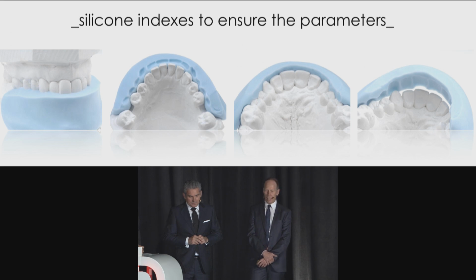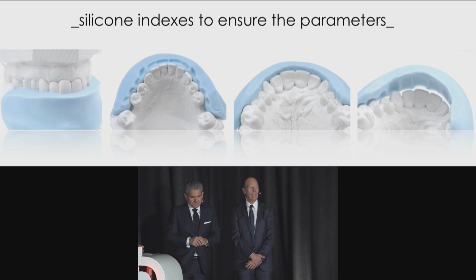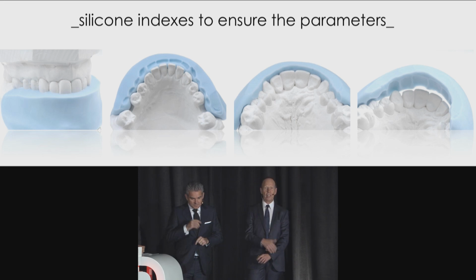So we have a certain kind of protocol in the lab. As Iñaki told, we have a good provisional. We try to copy as well as we can the position of the provisional, what you can see. So we do cross-mounting. It means that we put in the articulator the model with the provisional, and then we have a labial index to see where the contour is when we close the contour of the arches of the upper jaw when we close the articulator. This is good for the stratification, so that we don't come out of the arch.